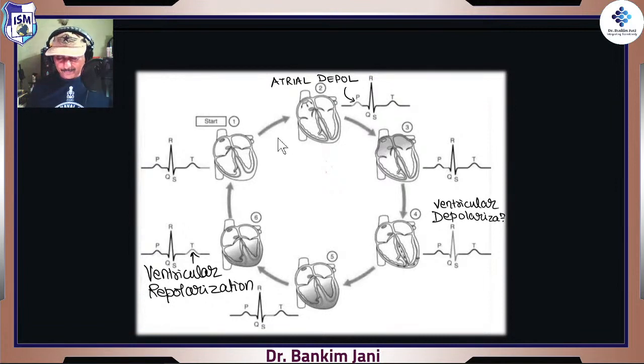Now we add some process to that. Let's add how we really link ECG with the cardiac cycle. First things first, here is the point from where we start. Here is our SA node. Just feel that this is the location of our electrode, and we have to watch everything from that perspective, as if you are sitting over here.